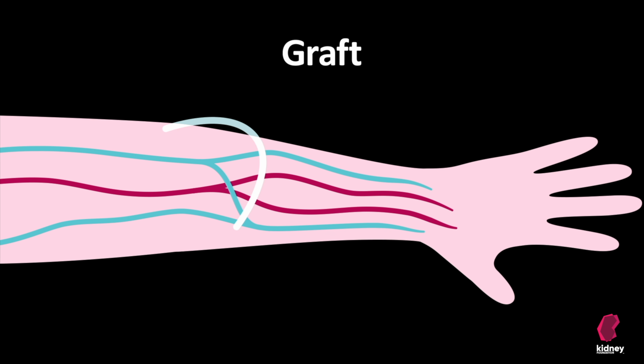The third type of hemodialysis access is the graft. A graft is similar to a fistula. For a graft, a vein and an artery in your arm are connected together under the skin by a small plastic tube. This tube is under your skin and is not visible. From the outside, it looks similar to a fistula. Like a fistula, a graft requires needles to be inserted at each treatment.